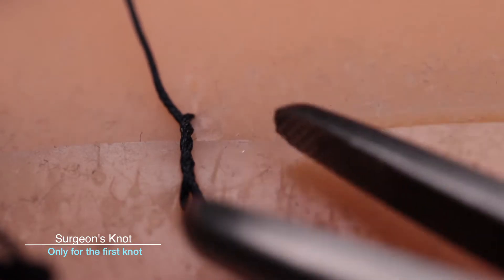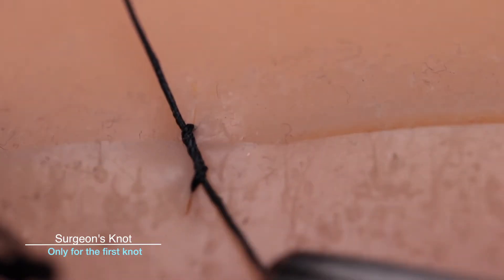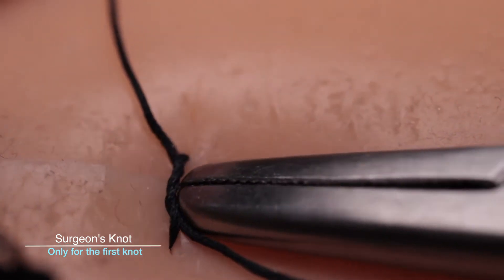By wrapping the suture around twice, you're creating a surgeon's knot, which is to be used for the first knot only. This way it is less prone to slipping. However, you are at risk of creating an air knot, which means that the ends of the wound will not be tight.